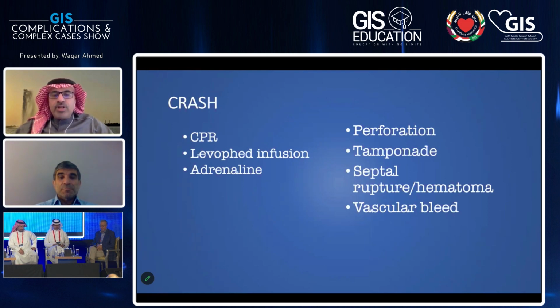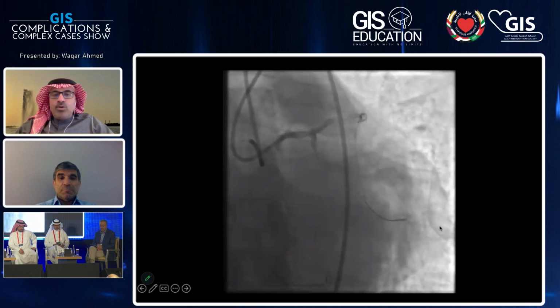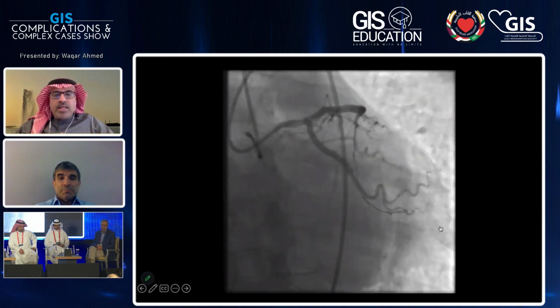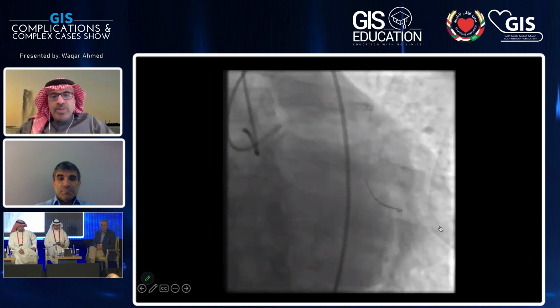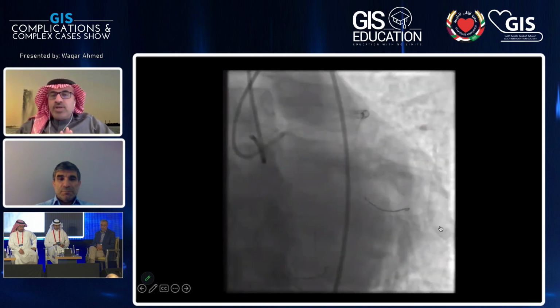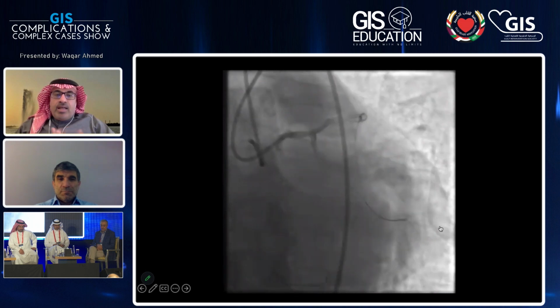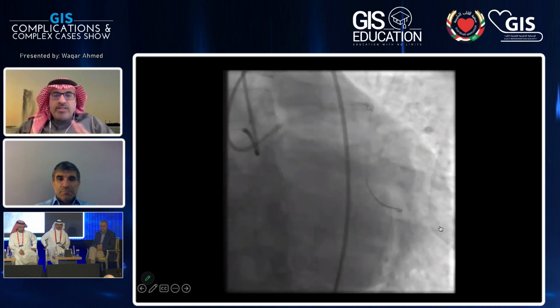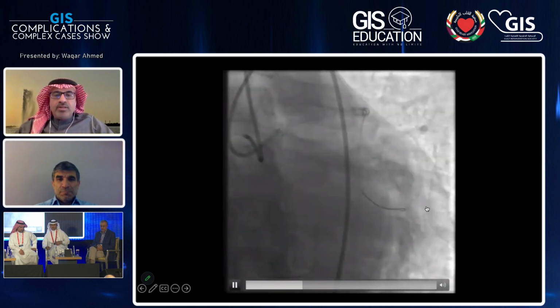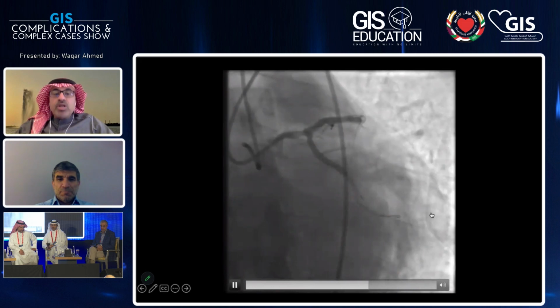And obviously went through the differential. Is it a perforation, tamponade? Is it septal rupture, hematoma? Is it vascular bleeding? Echo, we have an echo machine in the cath lab that came immediately. No tamponade, absolutely no bleeding. The septal collateral is fine. And this is the donor vessel. And obviously this is while we're doing CPR, and you can see the heart is not really moving much.